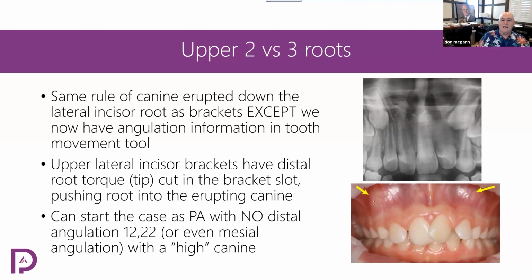And that you use your finger. And I can tell you, I don't know, let's say like 50 consultations where there's an overlap with a lateral incisor and a canine. I can't tell you, yeah, there's one, probably Dr. Hisham. But everybody else, nobody says, yes, I took my finger and it's on the labial. I'm sitting there looking on the photos, looking for this bump, and if I can't see it, then I guess it's probably on the palatal, you know? So I would sure like to reach into that photo and see if I could feel the canine.